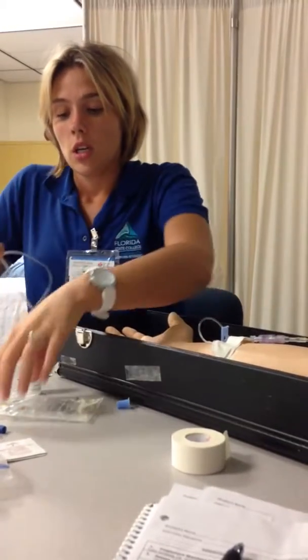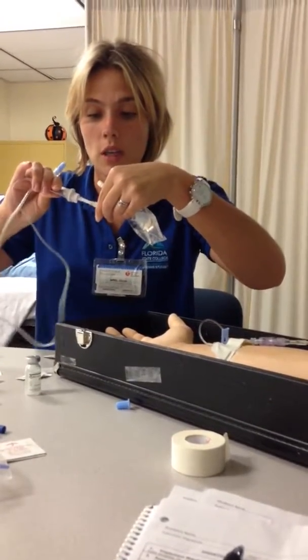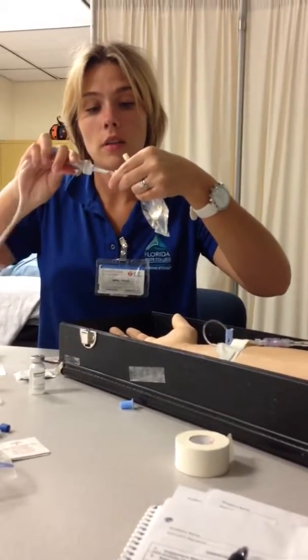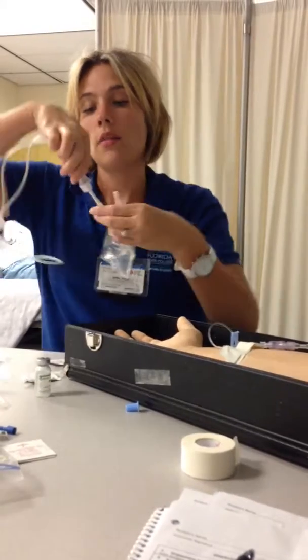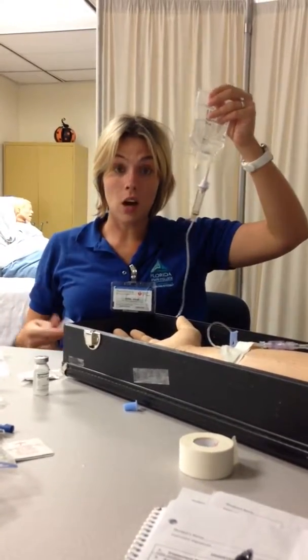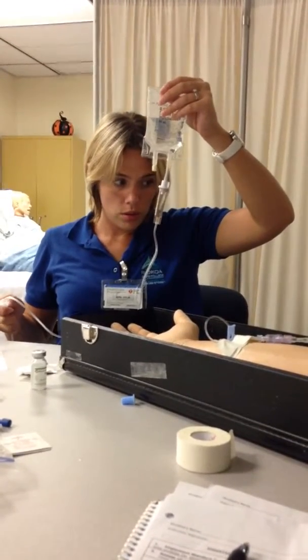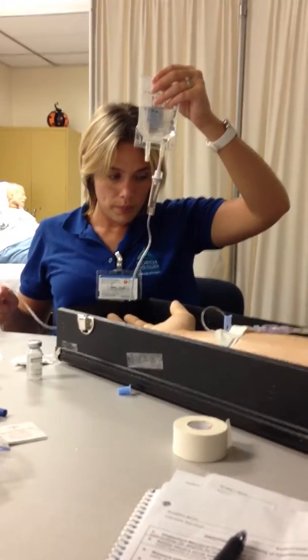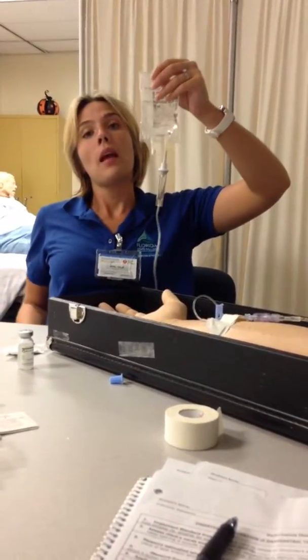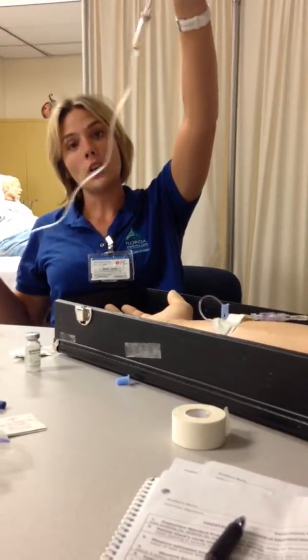I am going to inject. This is sterile. I've just pulled the cap off. Inject it in. I'm going to clean this. This is sterile, and I'm going to inject it. Alright, let it fill up. Prime my tubing. The action of priming my tubing is to get all the air bubbles out. Alright, I have air, I have water, the medication all through the tubing, so now I'm ready.